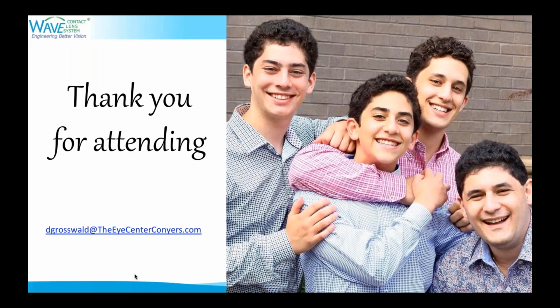And once again, the rotational stability with Pentacam is far better than the placido-based topographies, where I was guesstimating where the scleral curvature was, and just basically making a steeper slope at 12 and 6, and letting the lens rotate. But still, there was a great deal of unpredictability. They'd come back a week later and rotate somewhere different. So with all that said, usually, 1 set to 2 sets. Okay, great, thanks. Yeah, we did have a question about how many lenses it usually takes. So I think you answered that as well.